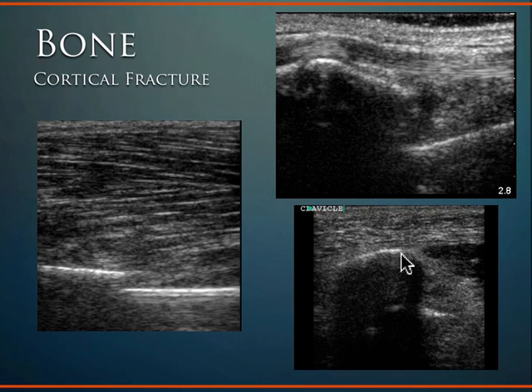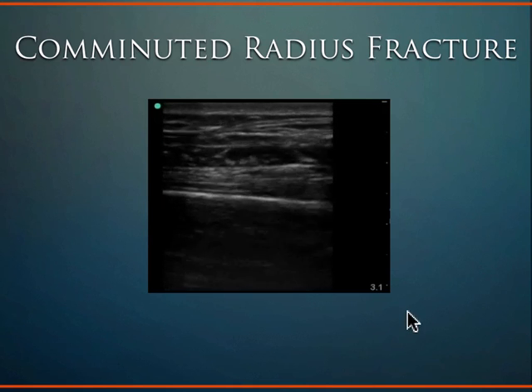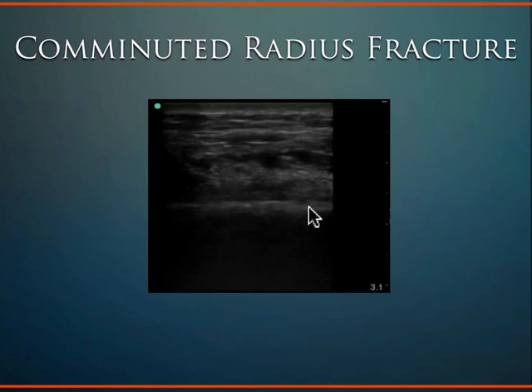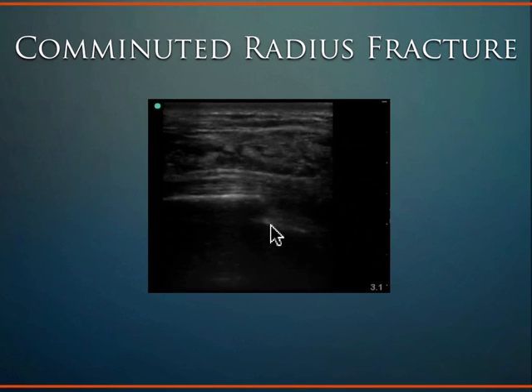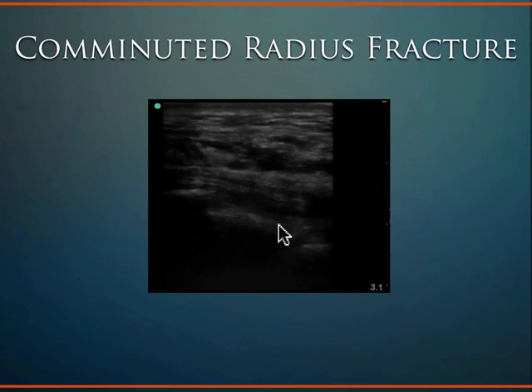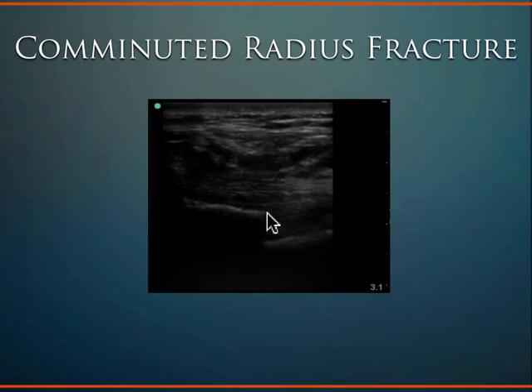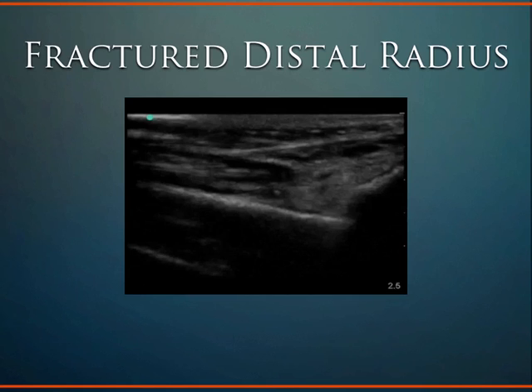And then this distal clavicle fracture, a very, very common step-off type appearance and displacement of the bony fragments. This is a comminuted radius fracture. You'll see the continuity of the cortex line here, and then eventually you'll come into play here where you're shadowing, a step off to this cortex line here. And then as we move further along, you'll see another step off down to here. So there's basically two fracture lines, comminuted, multiple fracture locations. Again, seen very exquisitely with the ultrasound.